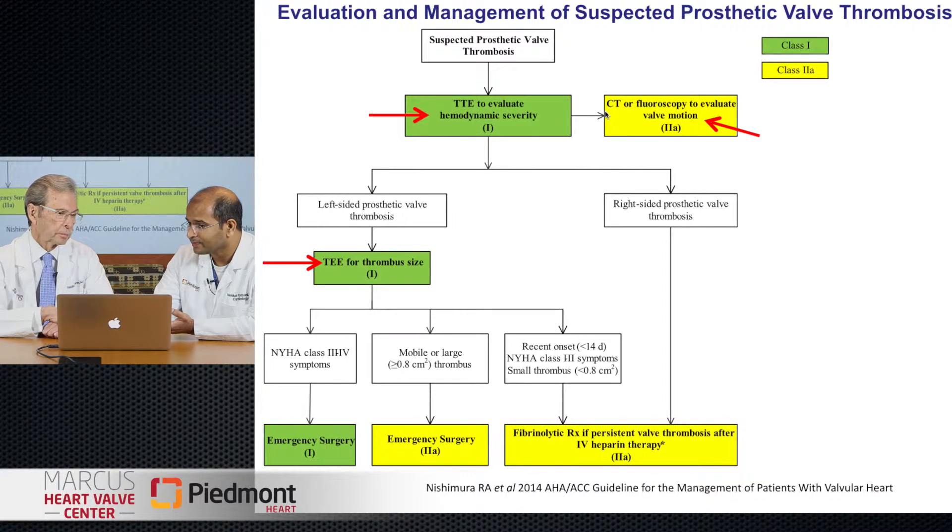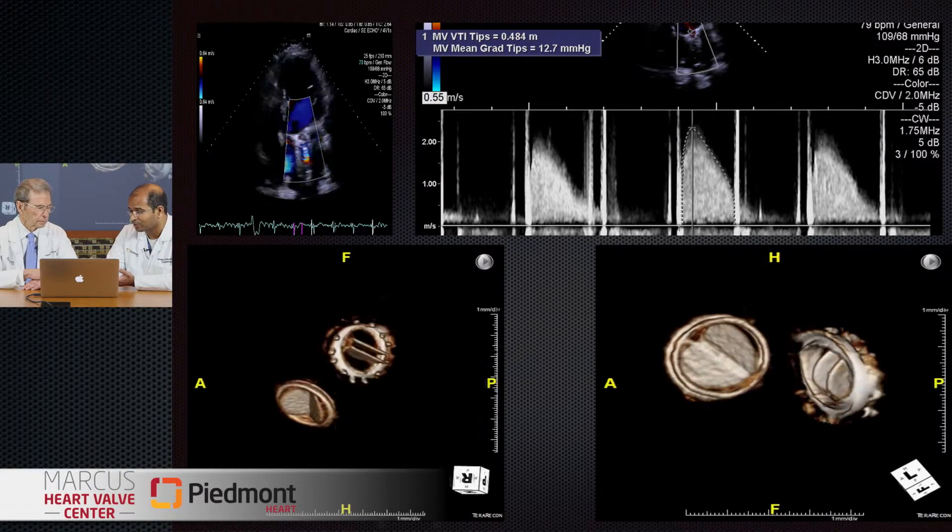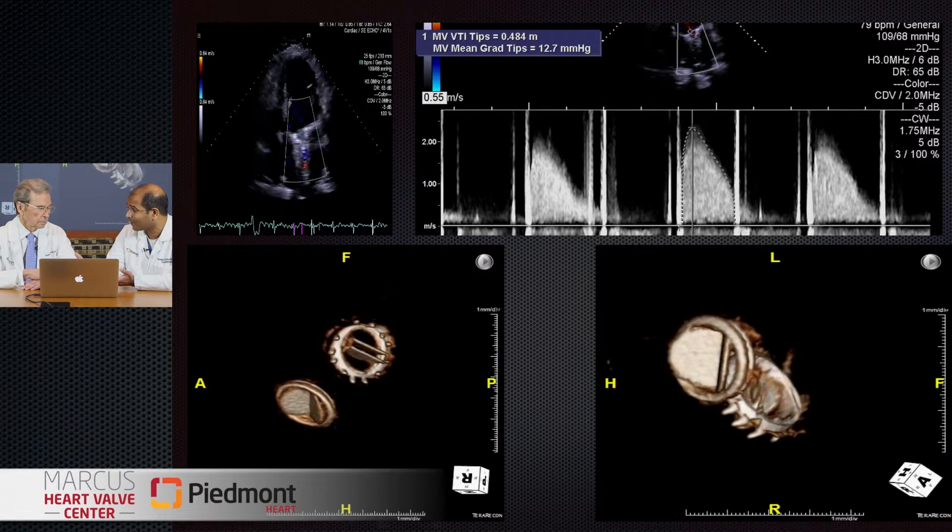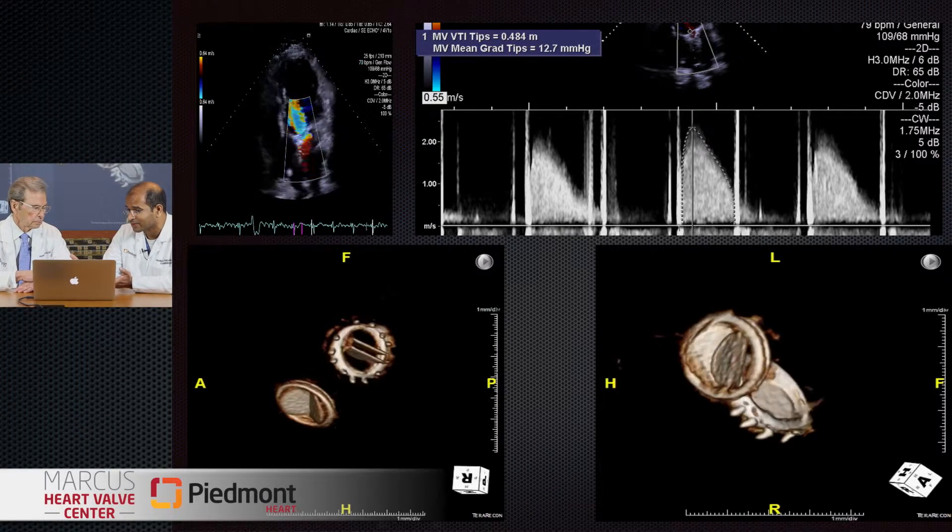Most people historically would not have thought of bioprostheses as showing early thrombotic changes. The first case we showed was probably within a year of implantation — that's really very interesting. I'll also share a couple of cases of mechanical valve assessment by CT. In this first case, the patient had endocarditis and had both aortic and mitral mechanical valves. The Doppler gradient was slightly higher on the mitral valve inflow.